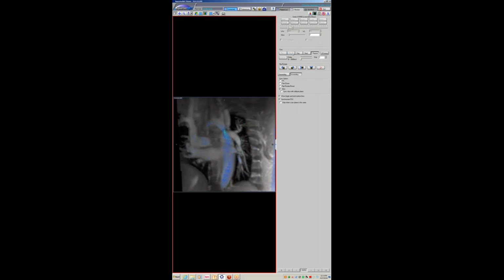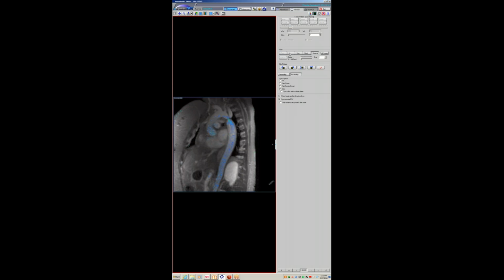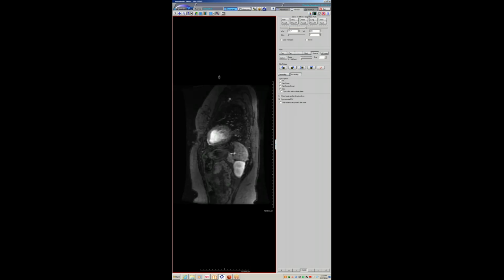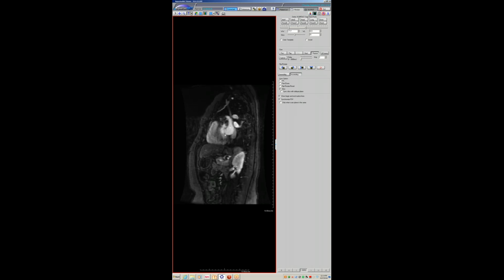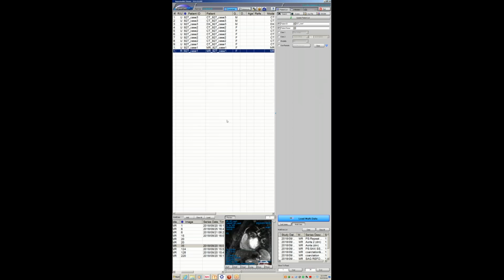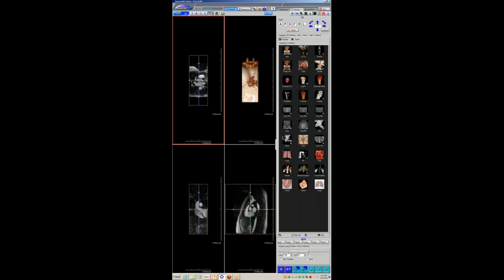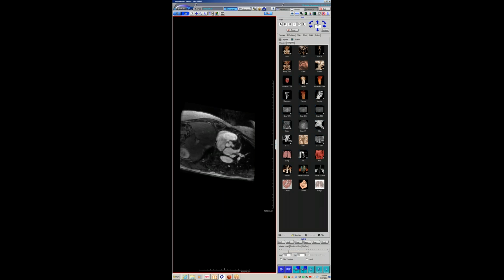And then you could see, this is just showing her PDA, or her coarctation on the 4D flow. And I think she had an old study, and I think people were just kind of focused on this coarc, because what you notice on the MRA images is that there's this weird outpouching right here. And that's really all that you see on this. You also see the valve is bicuspid. This woman was treated in India with some unknown surgery. But then here's actually a MRA from about 5 years before. And again, people were very focused on the coarc. And you can actually see here, even on the new study, that there is, in fact, this very interesting outpouching here that does not belong, somewhere between the annulus and the left sinus.